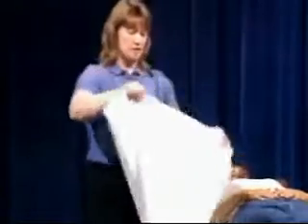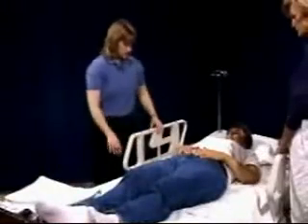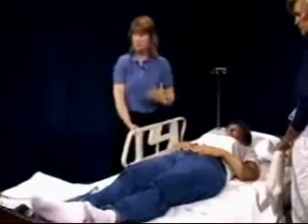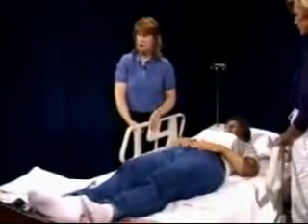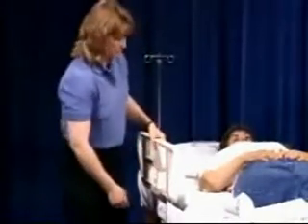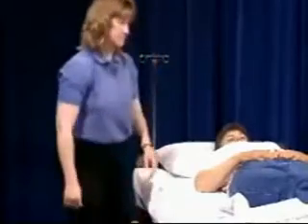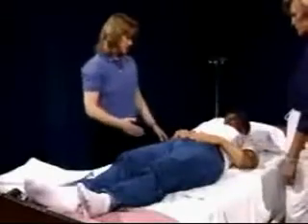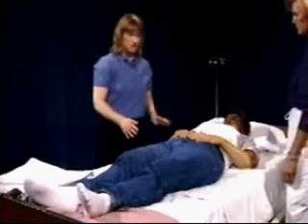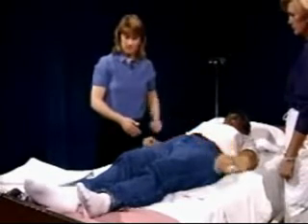We won't put this one under the patient because there's already one placed there. When we do this, we want to make sure that we have the bed up to a position that's comfortable for us and isn't putting strain on our backs. And we'd also want to lower the arm rails, the bed rails, so that they're not in our way. Remember, we want to explain to our patient what we're doing and just let her know that we're both here to help reposition her in bed and to help her feel more comfortable.